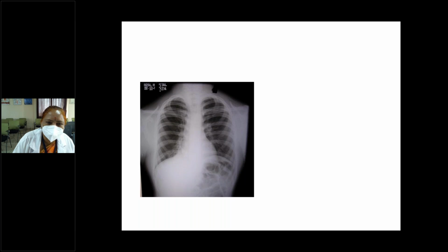Roll number 100. Absent or present? Present, ma'am. Just read the X-ray. Ma'am, it's a plain X-ray, PA view. Plain X-ray of the chest and abdomen, upper part of the abdomen. It's in PA view, ma'am.